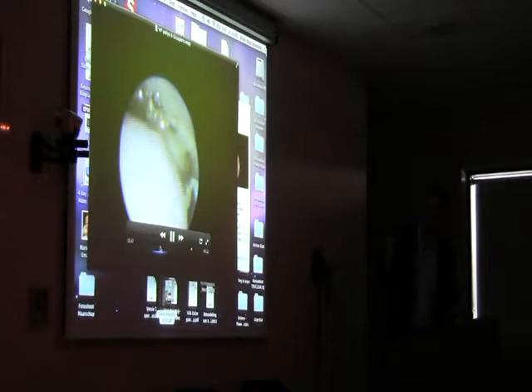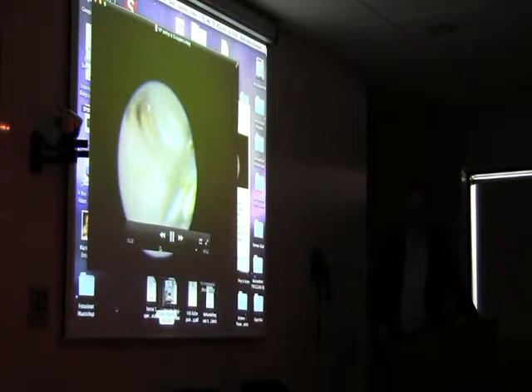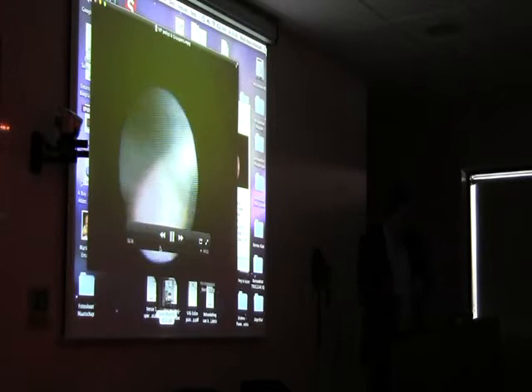It's like in general surgical practice, where we always want to see where we are, but in the uterus, we can just do everything blindly, just put something in there and grab. But here, we do it all under vision, but we have to use a grasper and another pass to actually get the polyp out. And this is all vaginoscopic. So we're in with an electrode, pull the electrode out, take the grasper, and off you go.